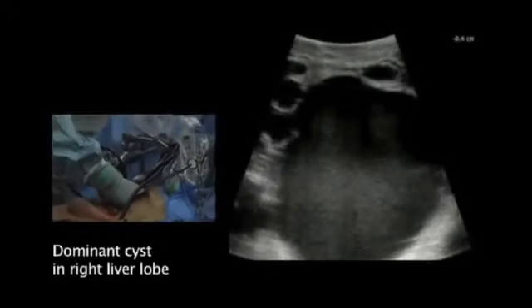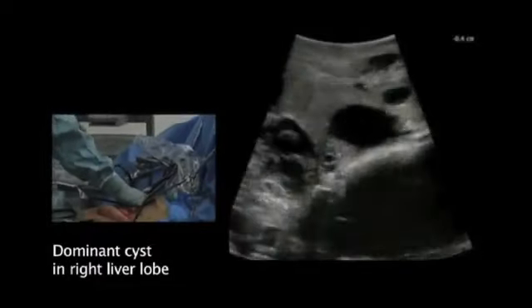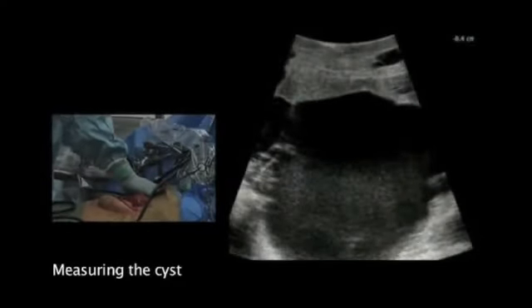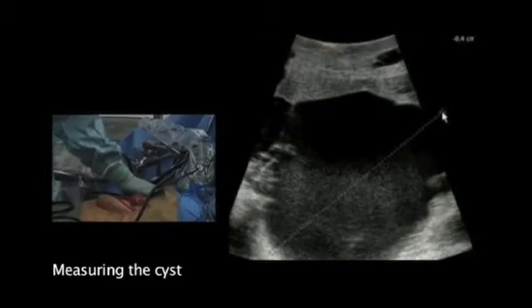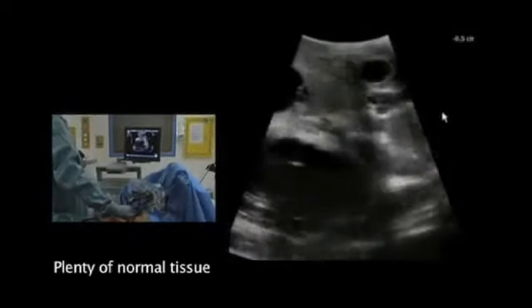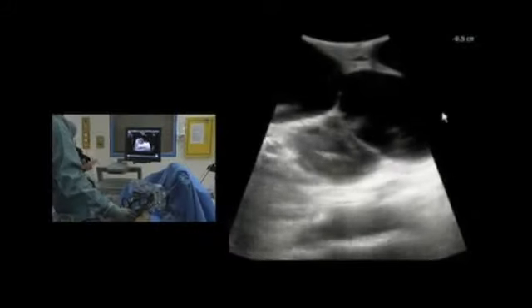We have a large dominant cyst and I'm keeping my transducer a little bit right of the midline of the liver. So that would be in the right lobe of the liver we have this dominant cyst. We can try to take a measure on it just to have an idea what size we are speaking about — and we are speaking about a size of 11-12 centimeters. We can see there is plenty of normal liver tissue in between, but there are some quite large dominant cysts and a number of smaller cysts as well.